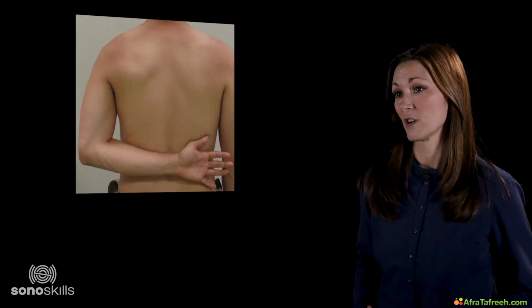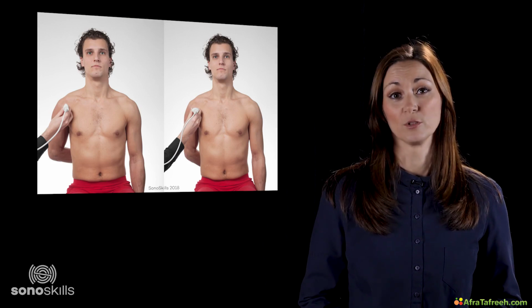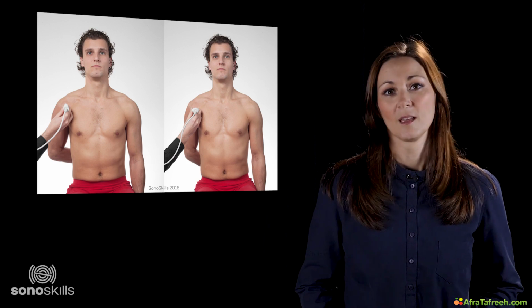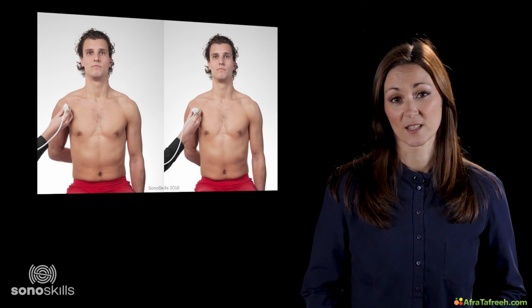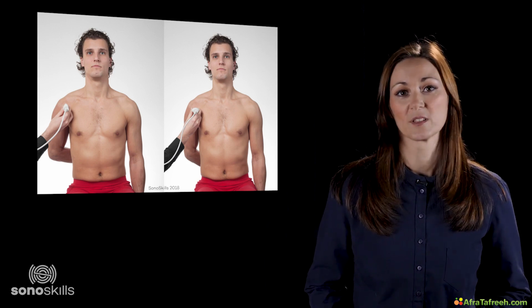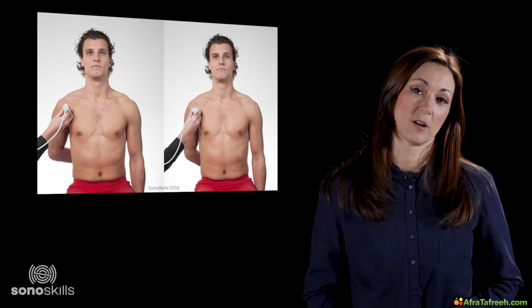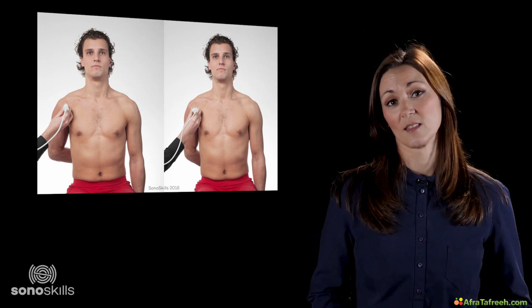If the patient sits in the CRASS position, the shoulder is in extension and full internal rotation. The dorsal hand is placed on the back and the upper arm close to the chest. The extension of the shoulder ensures that the supraspinatus adopts a ventral position. It appears from the subacromial space. Not extending the shoulder results in not being able to scan a big part of the supraspinatus because we can't scan through the acromion to visualize the supraspinatus. So, in order to visualize it, the patient needs to extend their shoulder.